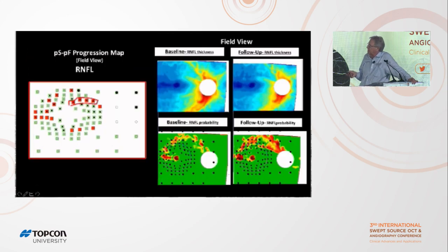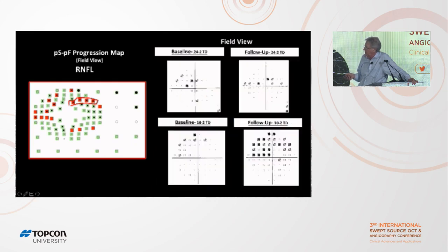All right, so now look at this. So here's a cluster, for example. This is all based on the thickness map, by the way. And that would be there to there. Well, you can actually see it's changing, but you would never believe it if I didn't have this quantification, right? And then it goes from there to there, right? And then on the visual field, you're going from there to there.